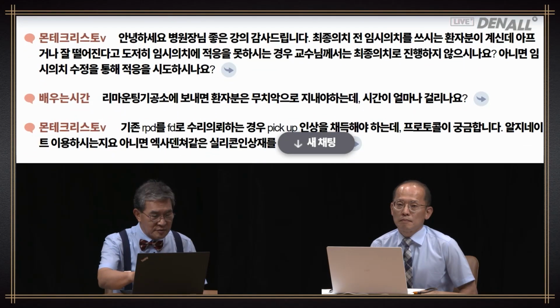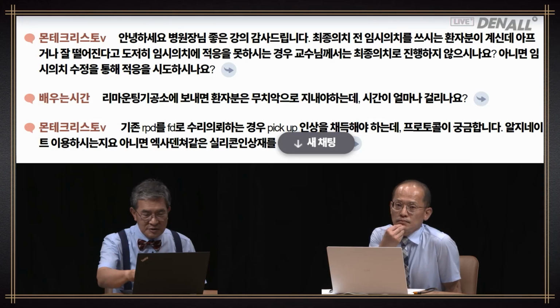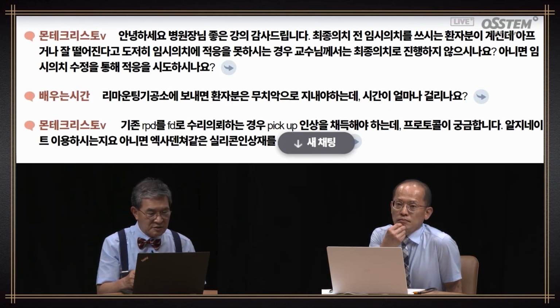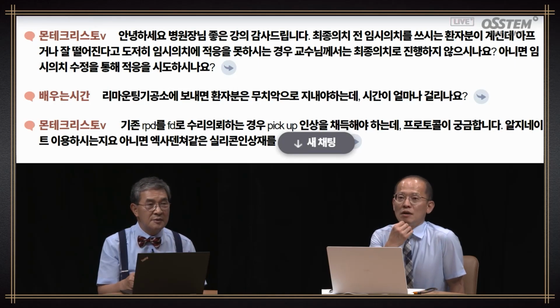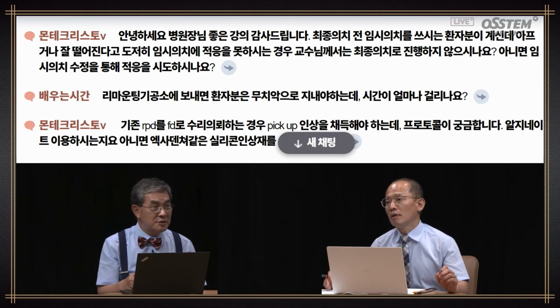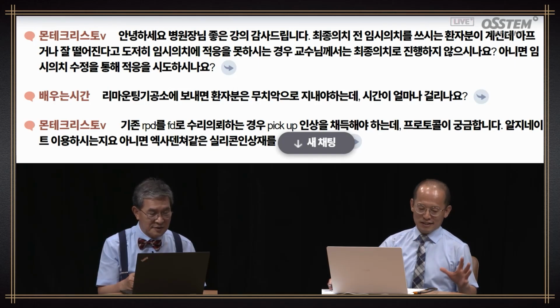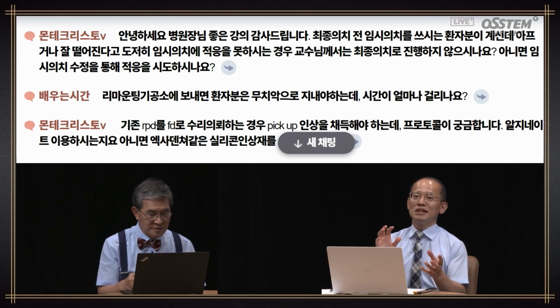Next, Monte Cristo V says, thank you for a good lecture. For patients that are using a temporary and cannot adjust because it's too painful and doesn't fix in its place, you don't do the final denture in this case. I don't do a final prosthesis for this. The temporary is also a denture, and a temporary should not be of very low quality.